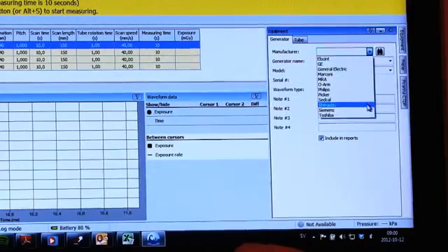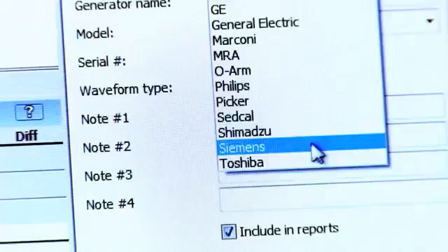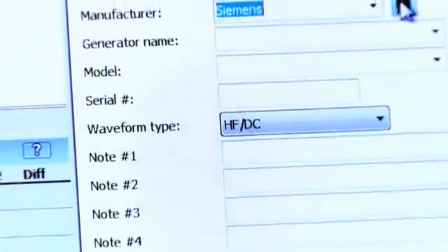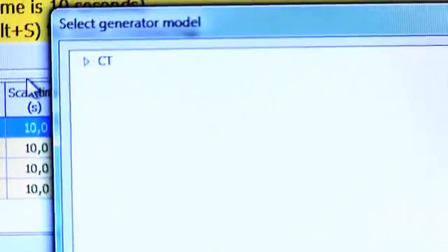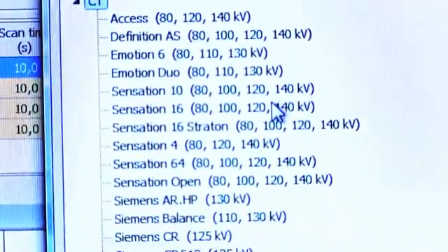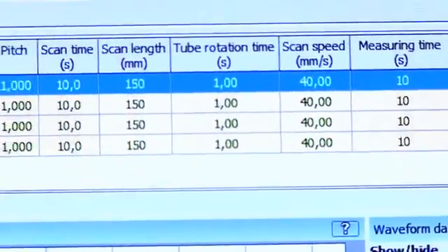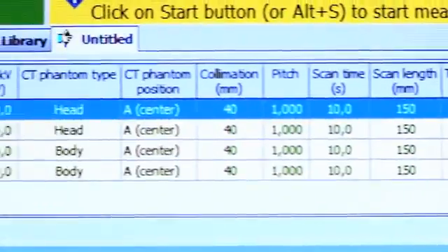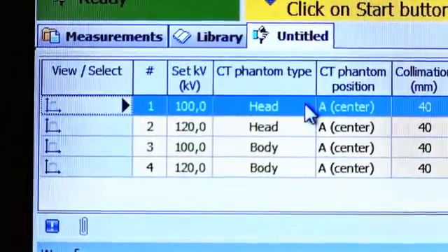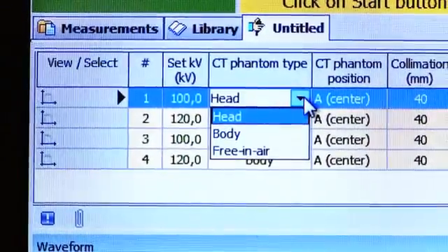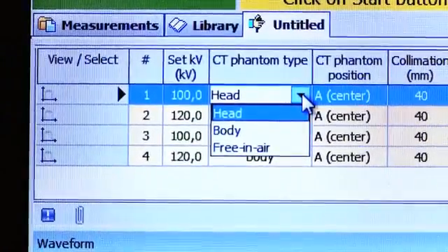To begin, ensure the CT manufacturer and CT type are selected. This is to get the right K factor. The K factor is what allows the CT dose profiler to extract all the parameters in one exposure. You must also select the correct measuring mode. In this case, a measurement in a head phantom.